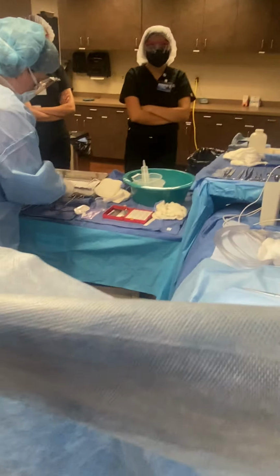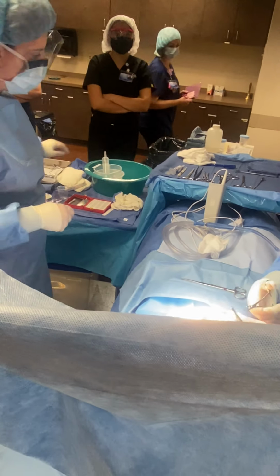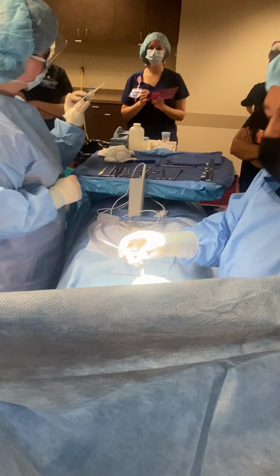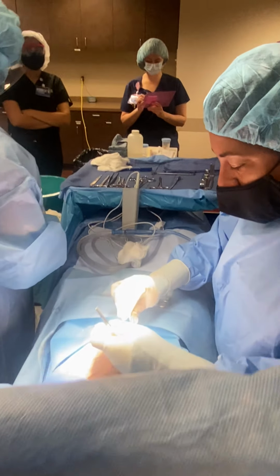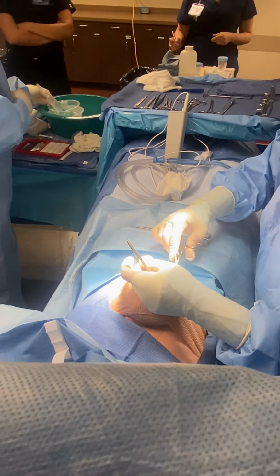Three. Counts correct. Thank you. Do we have our local amount yet? No, she hasn't injected more yet. I think I'll be fine. Okay, then you gave her some good anesthesia. 2 mLs of 2% xylocaine with epi. And then irrigation, we use 120.